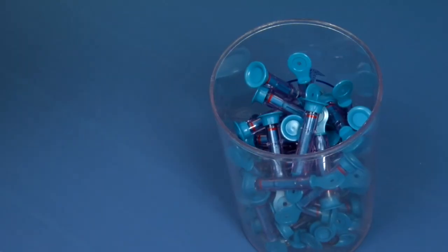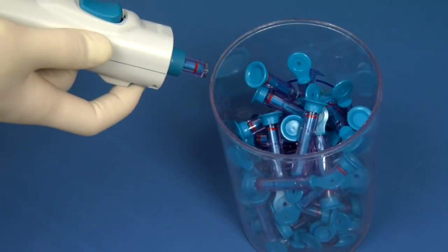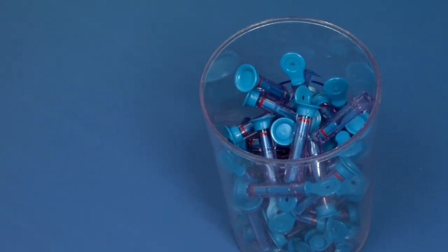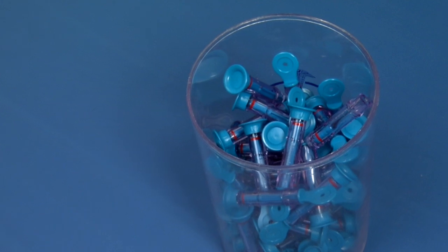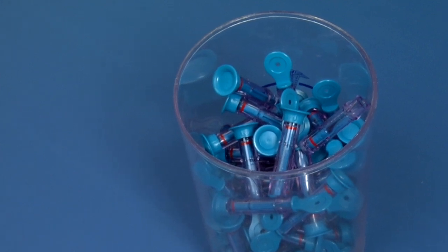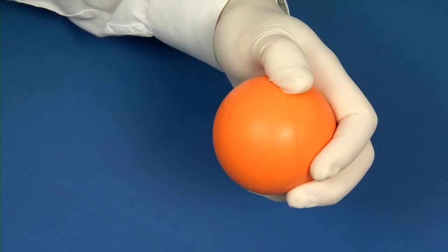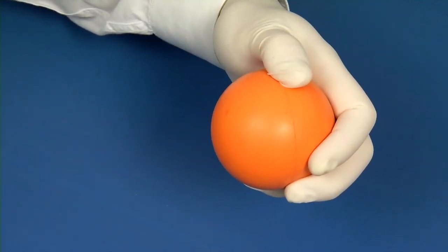Removal of the syringe from the injector is accomplished by pressing inward on the ejection button under the injector. Dispose of the used syringe per standard procedures. It is not necessary to recap the needle-free syringe prior to disposal. Before injecting a patient, this process should be repeated until you feel confident.